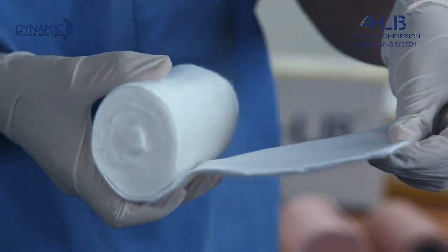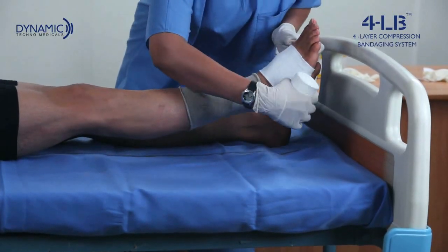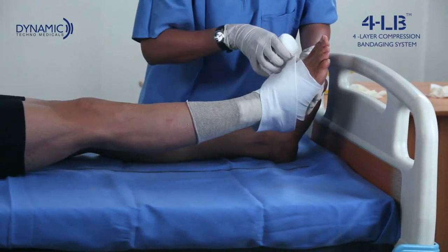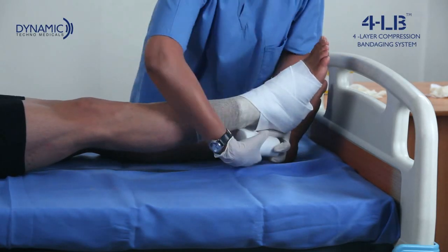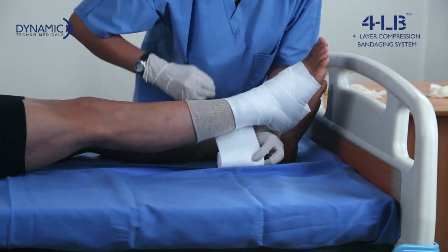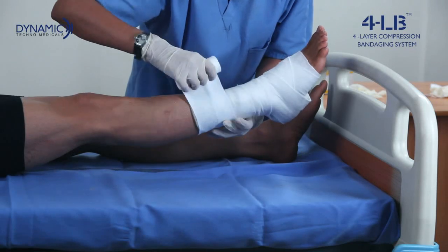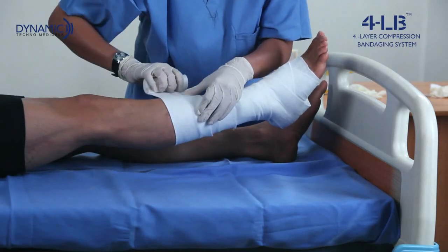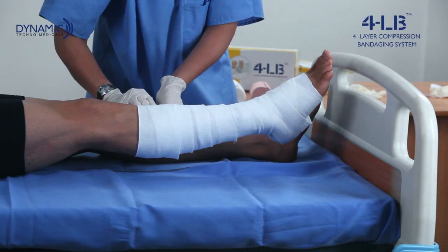Take care to keep the ankle at a 90 degree angle before you start. The bandage should be applied starting from the base of the toe, in a figure of eight pattern around the ankle, and continue up the leg in a spiral pattern with 50% overlap on each turn, covering the calf muscles, finishing just below the knee.